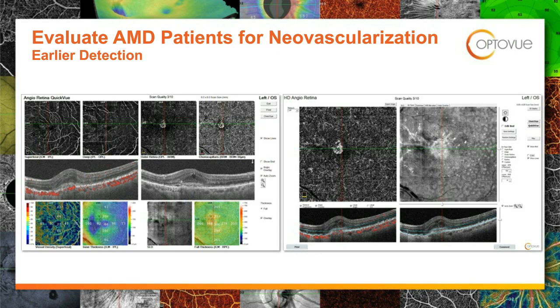And then if you still look at that same scan, the one that's on the left side, if you just go to that middle image on the left, you can see that activity of that blood right there, kind of in the middle, right where that little hump is. That's the choroidal neovascular membrane that has blood flow in it.